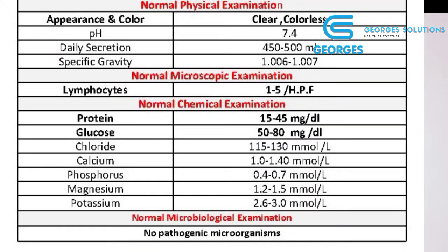The lymphocytes should be 40 to 80% in adults and 5 to 35% in children. The monocytes should be 15 to 45% in adults, 50 to 90% in children. The polys should be 0 to 6% in adults and 0 to 8% in children.